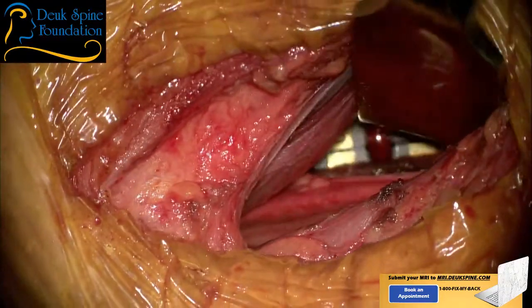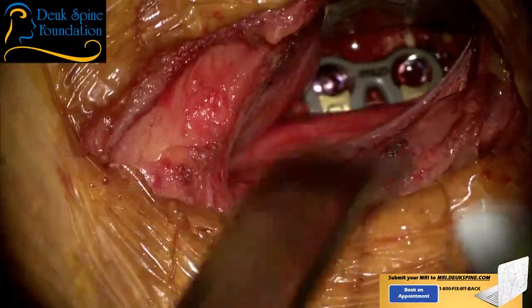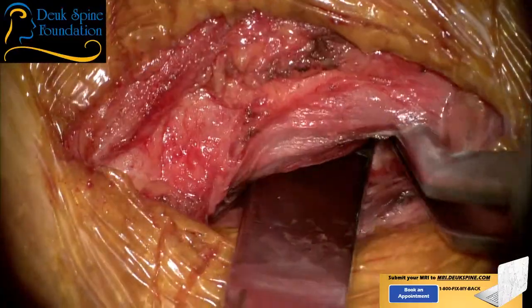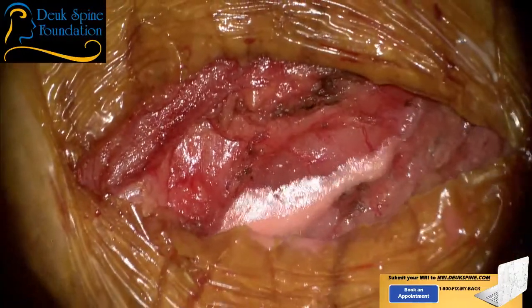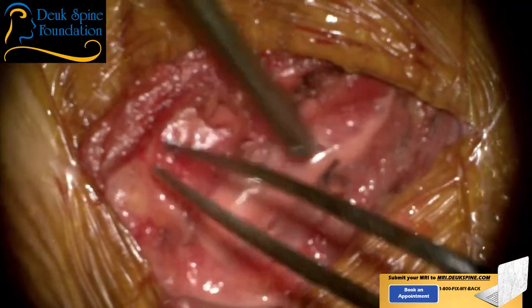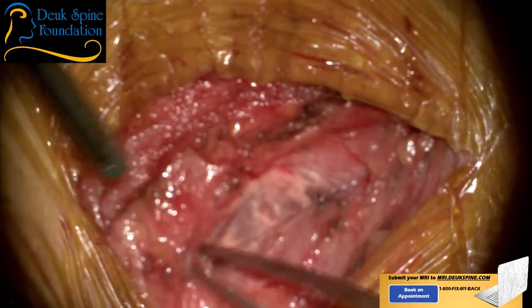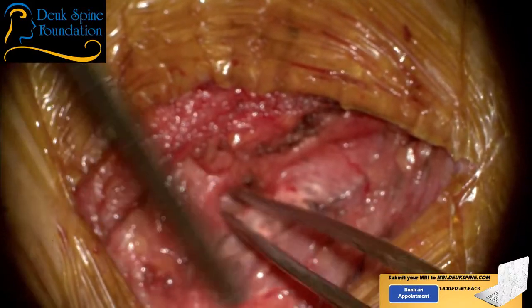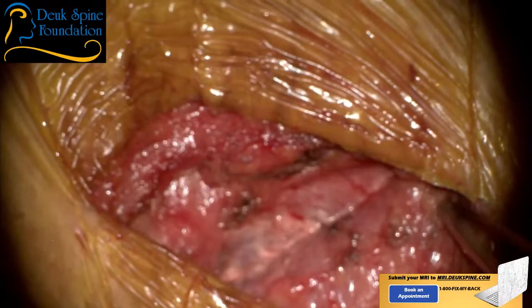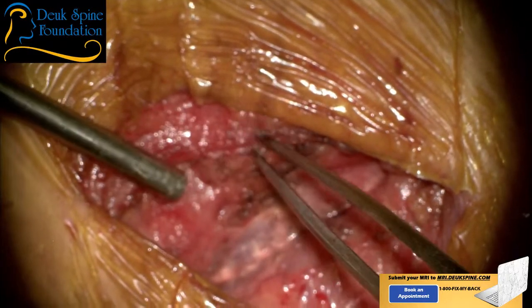Let's get our gel foam in there. Okay, you ready? Toe back, yep. Perfect, come on in, out. Good. Watch your eyes. All right, we're here at the surface again. Now, suck this, please. Let's keep our blood pressure good and low, like around 100, 110 throughout recovery. Perfect, love it. These are just little veins right there. Y'all see those little purpley veins? What happens is you'll be closing the wound and then your needle will hit one of them and they'll start bleeding. So I like to get them preemptively.